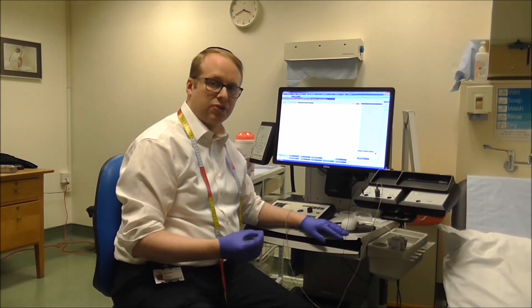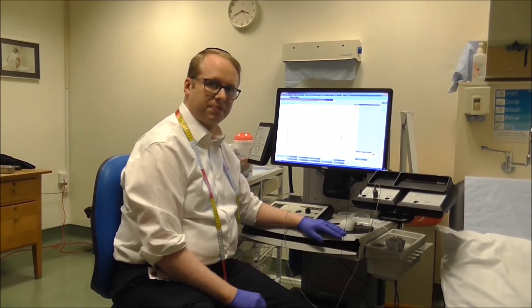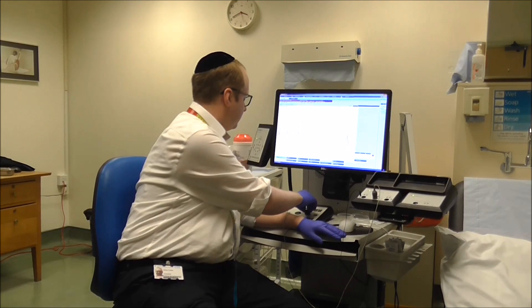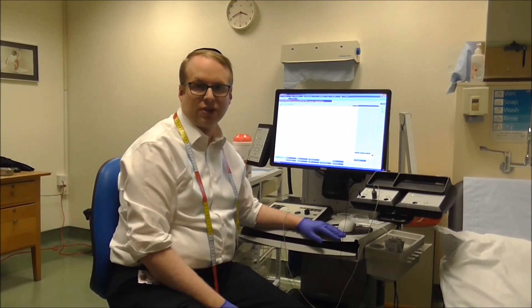The sound you can hear is the sound of my muscle as I lift up my fingers. And you can hear the sound of the muscle fibres as they activate.